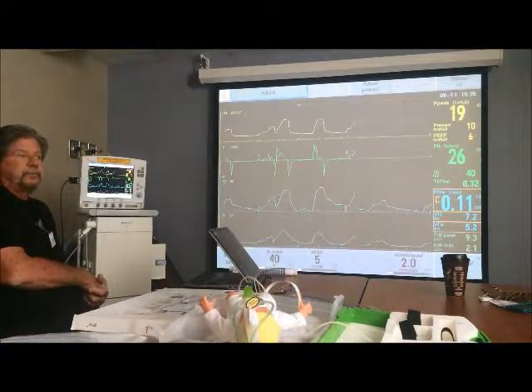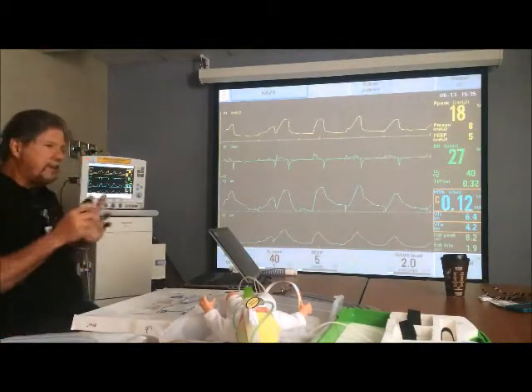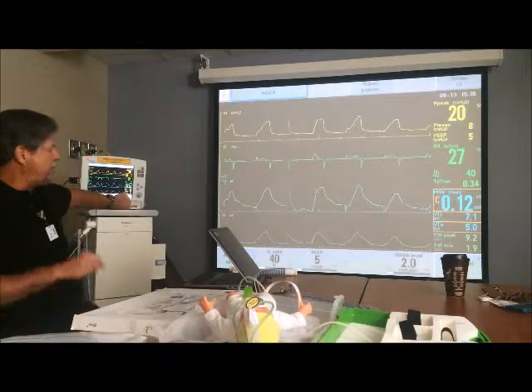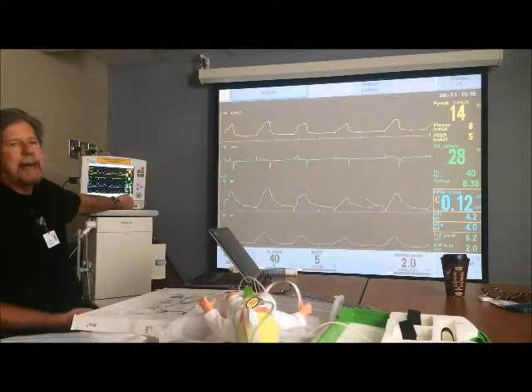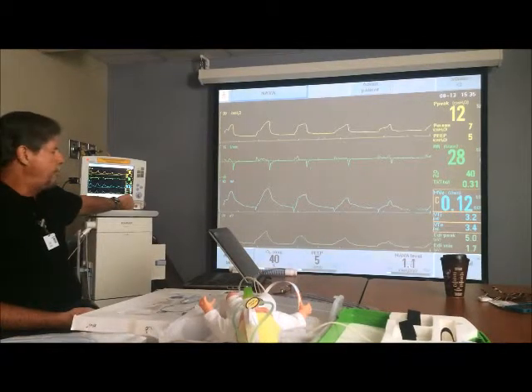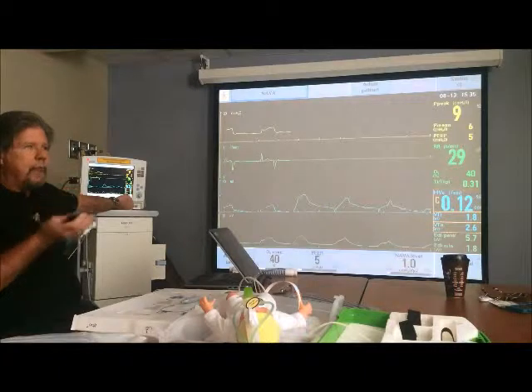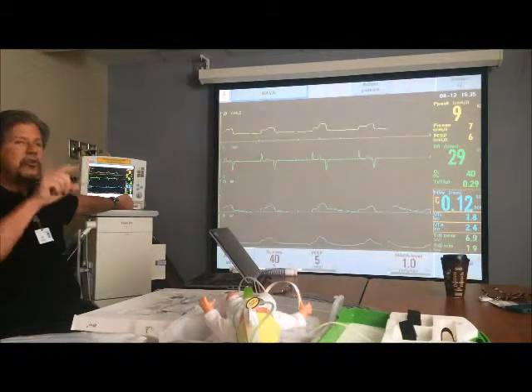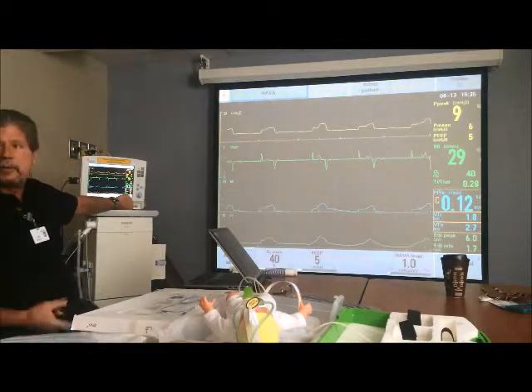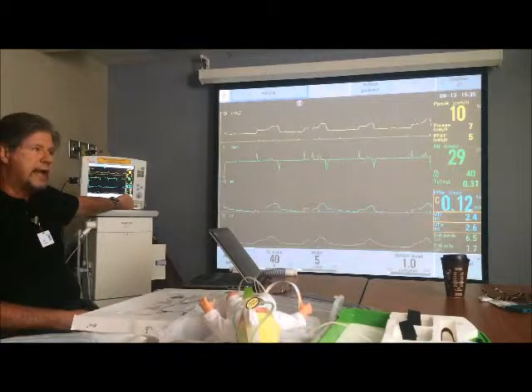Okay? So this is where we would use, and if we wanted to force a wean, we could say, all right, well, the baby's been on 2 centimeters support for a couple of days now. Let's see what happens if we turn him to 1. We know or suspect that his EDI should go up, but that's okay. He's going to be doing more work. The question is, can he do the more work for an extended period of time? That way we've turned his support down.